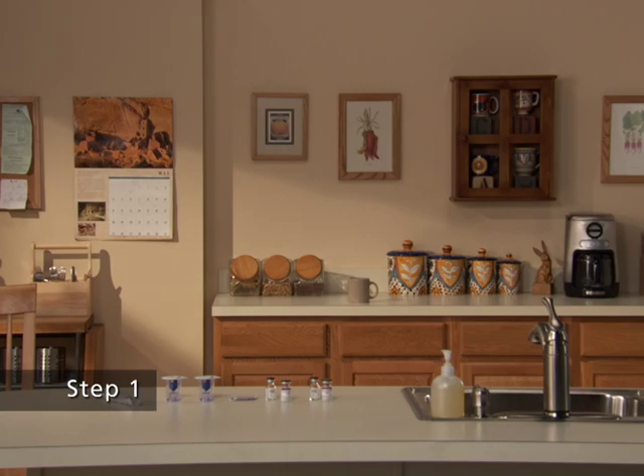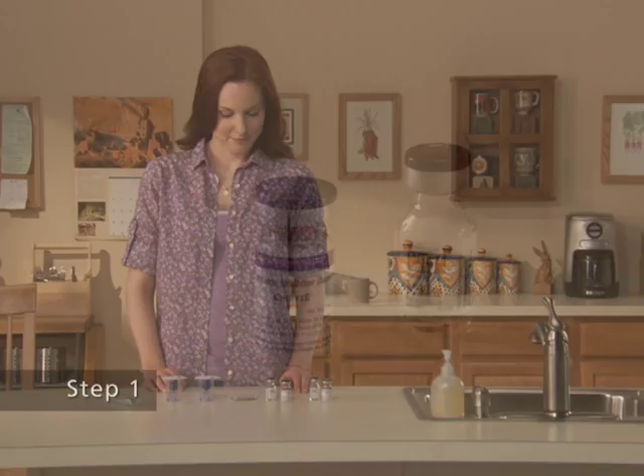Step 1. Let the vial of Synrise and the vial of sterile water for injection, USP, reach room temperature.